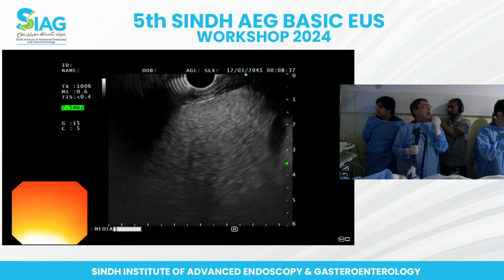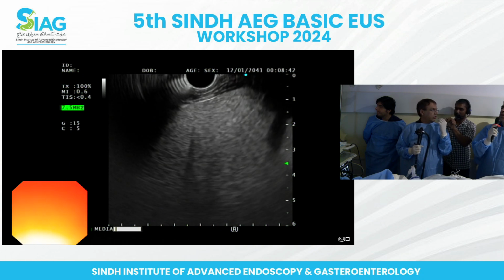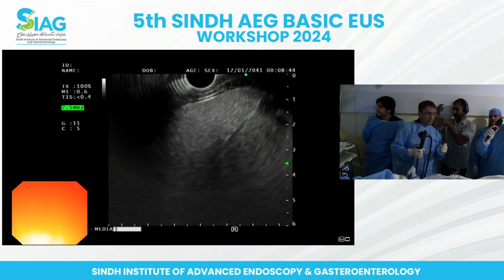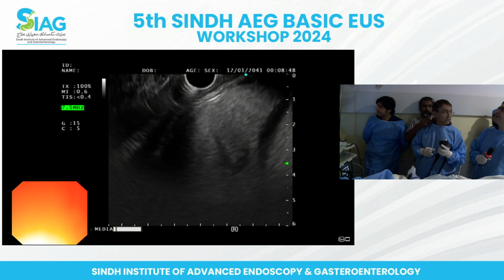इसको ज़रा और clear कर दो. हाँ. और क्लियर करो और उधर डाल दो. Can we project the slides, please, on the screen?